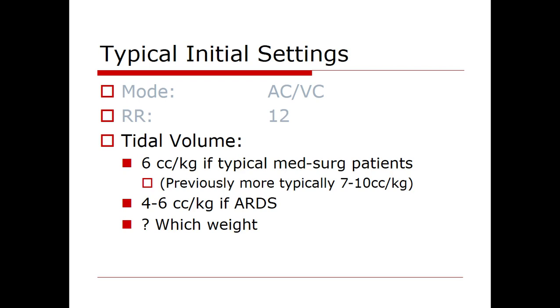And the way you should do that nowadays is to choose a tidal volume that's roughly 6 cc's per kilogram of ideal body weight. Okay? 500 cc's works if you have an 80 kilogram person, but really we should be adjusting it in this fashion. And in terms of which weight, it's ideal body weight. If I gained 100 pounds, my lungs are not going to get bigger. So that's really based upon your height. So every normal heighted person, if you chose around 500 cc's, you're not going to be bad off. But really, the new 2019 approach is to do it in a 6 cc's per kilogram fashion.